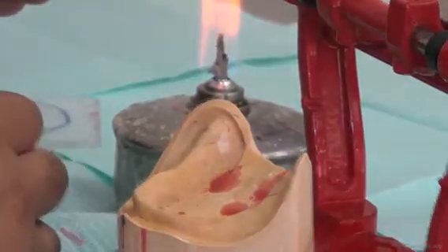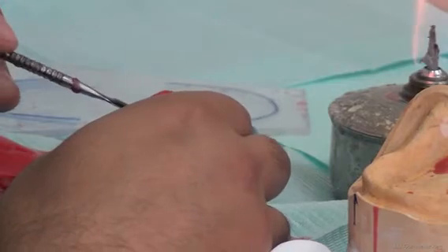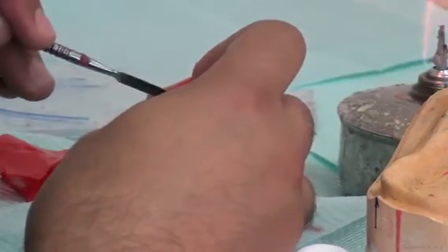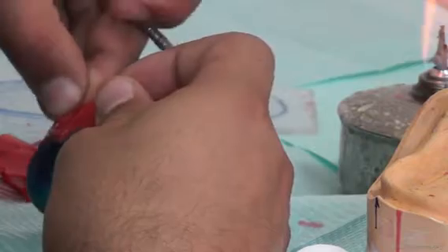If you want to be sure about the midlines, as we told you in the upper, you can place two central incisors together to make sure that the central incisors are on the midline. So here we are opening for the other central incisor.